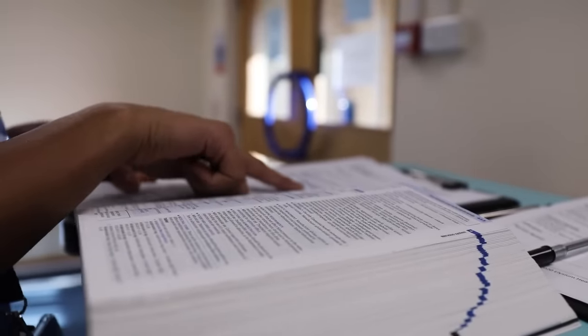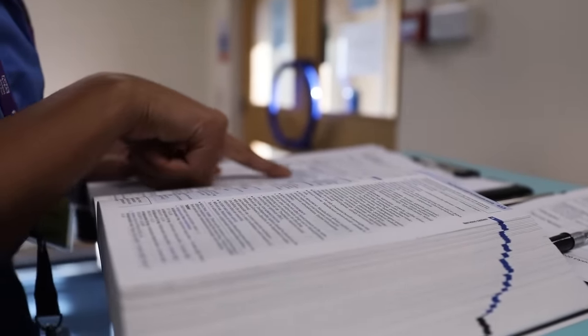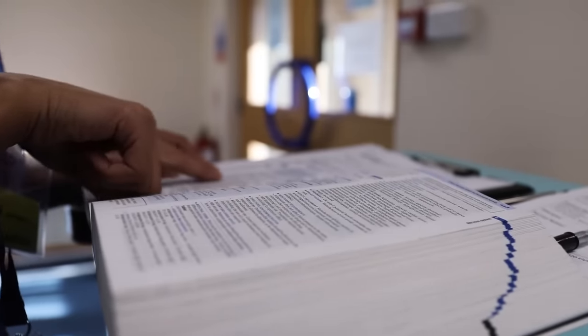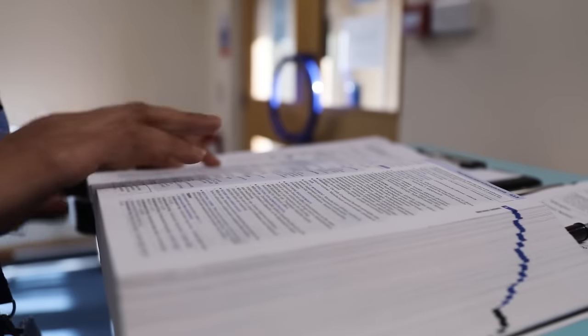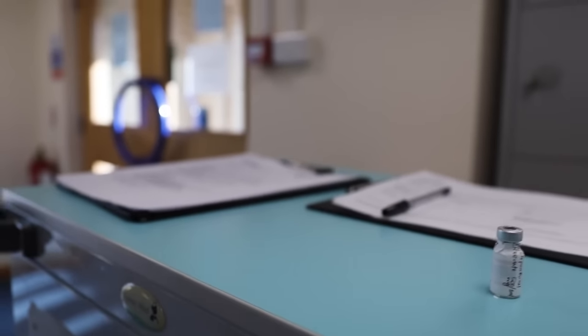So this is zuclopenthixol decanoate and it is given deep intramuscular, contraindication is CNS depression which my patient doesn't have, side effects can be anxiety or abnormal appetite. Okay. Now I'll be locking my trolley.